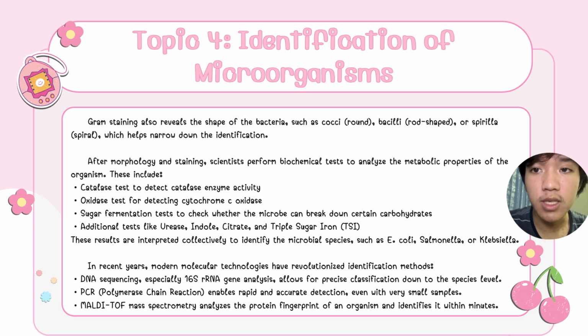In recent years, modern molecular technologies have revolutionized identification methods. DNA sequencing, especially 16S rRNA gene analysis, allows for precise classification down to the species level. PCR, polymerase chain reaction, enables rapid and accurate detection even with small samples.